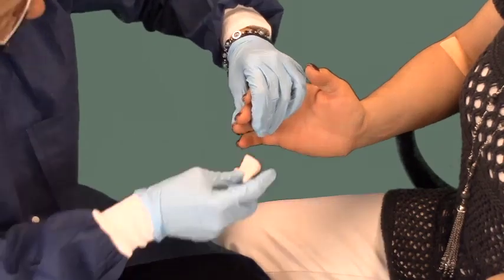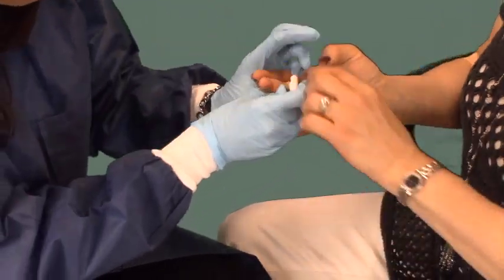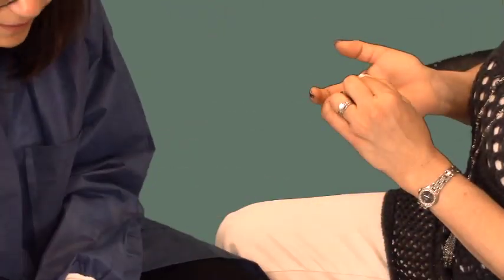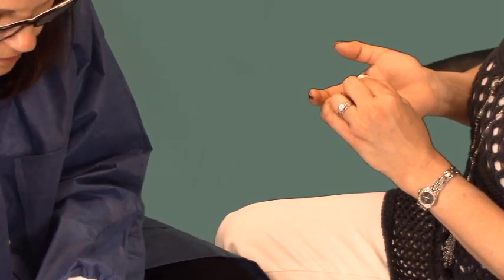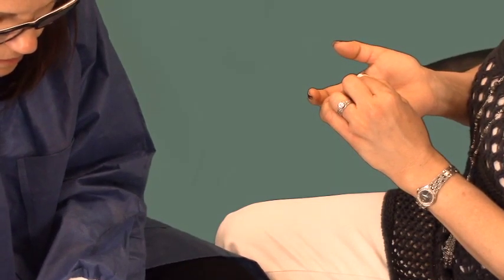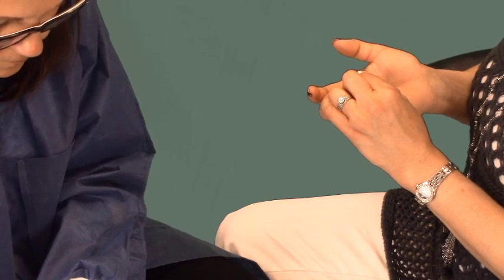Once you're finished, place gauze, not cotton, according to the newly updated standards of practice for phlebotomy, on the site and ask the patient, parent, or guardian to hold pressure on the finger. Discard your lancet into a sharps container immediately.